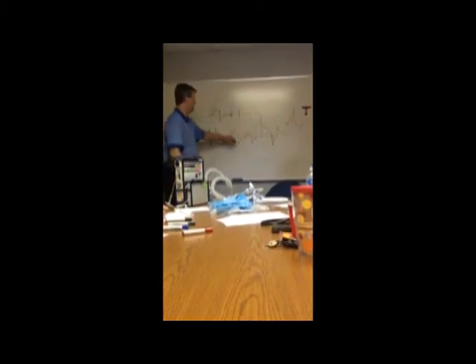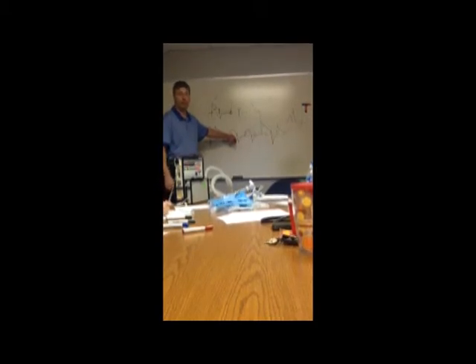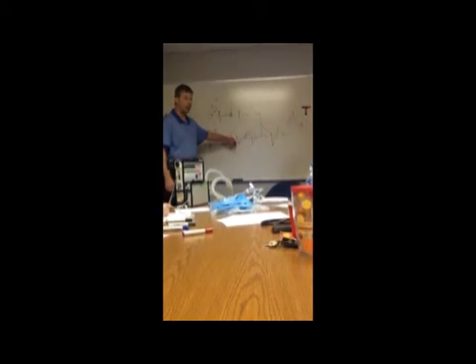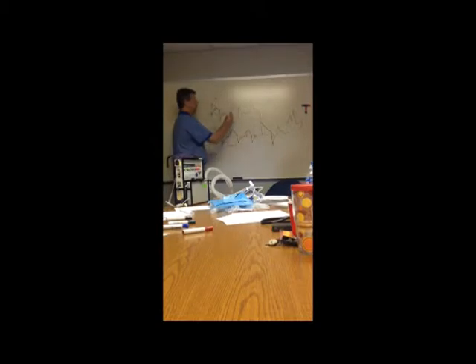Okay? So in between machine breaths on IMV, they can take a breath with as much air in it as they want. They can start it, stop it anytime, and they can dictate how much is in it. What dictates how much is in this breath and this breath, any of them, especially in these breaths, what dictates it is the amount you dial in, the tidal volume.